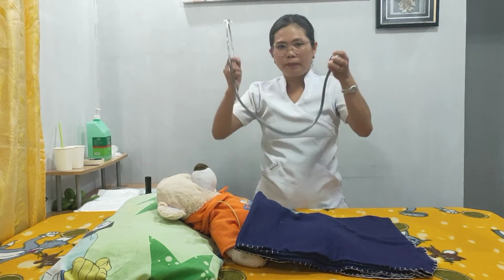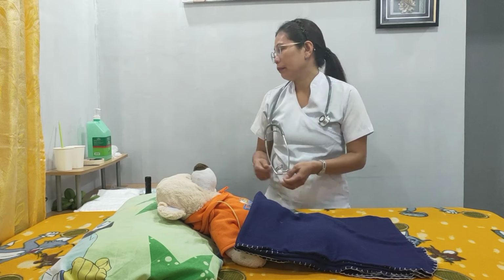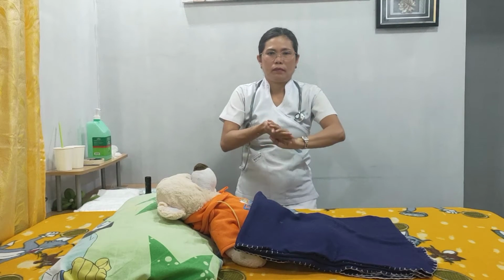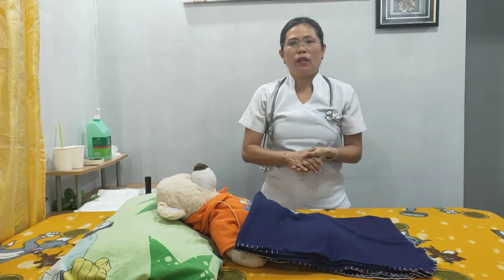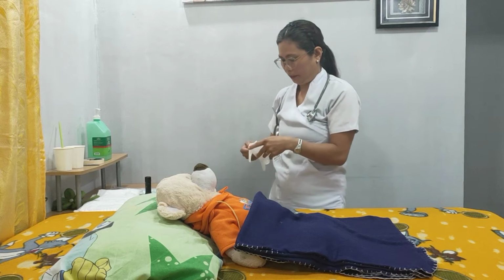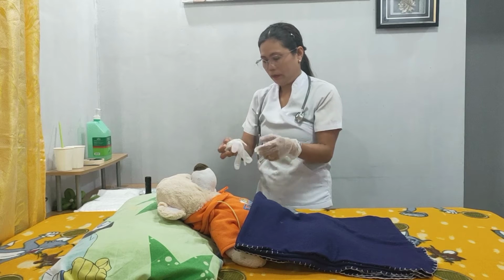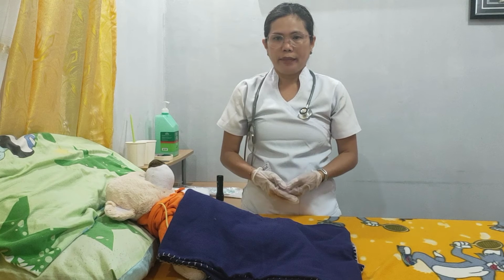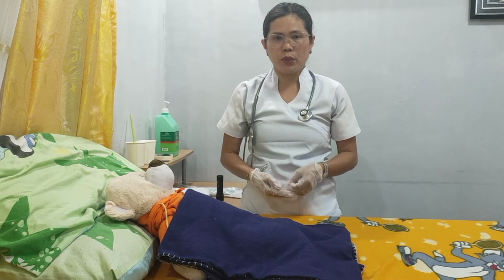You're doing good, ma'am. Next is to perform hand hygiene. Then, wear disposable gloves because hand hygiene deters the spread of microorganisms. Then, place your patient in high Fowler's position or semi-Fowler's position because upright position is more natural for swallowing and protects against aspiration if the client should vomit.